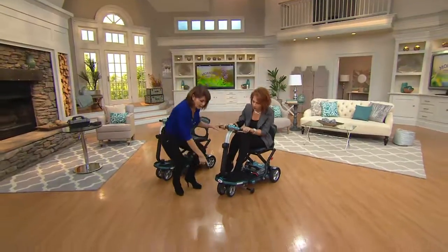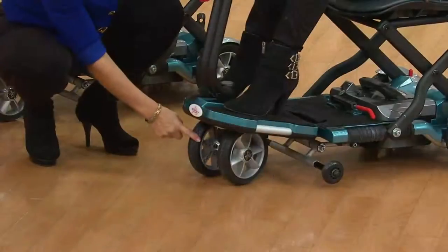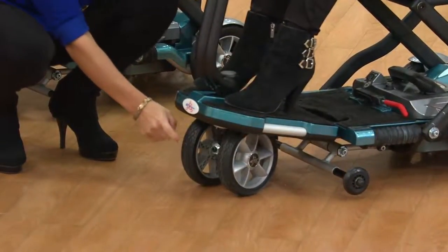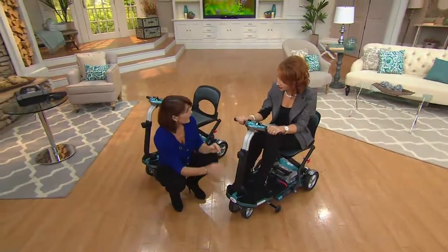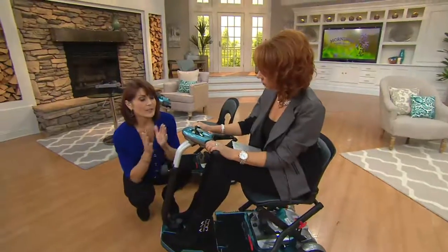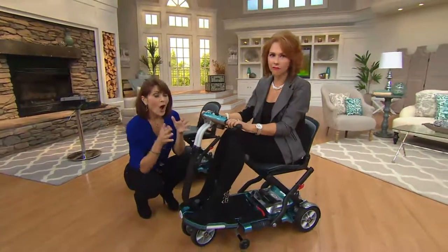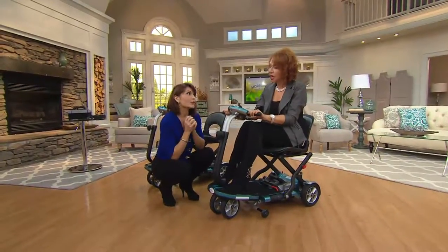These two wheels in the front give you a nice wide base. These are wheels that will never go flat — they're solid wheels, so you don't have to worry about getting a flat tire, even on different terrain. We also give you two additional stability wheels on the sides and on the back. When we say this is our easiest to use, most durable, most portable, award-winning scooter for excellence in manufacturing, it's a really great product.